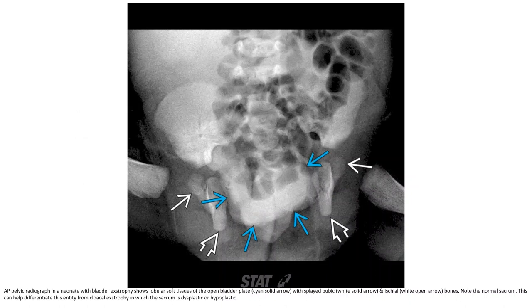This is an AP pelvic radiograph in a neonate with bladder exstrophy, showing the open bladder plate with splayed pubic and ischial bones. Note the normal sacrum. This can differentiate this entity from cloacal exstrophy, in which the sacrum is dysplastic and/or hypoplastic.